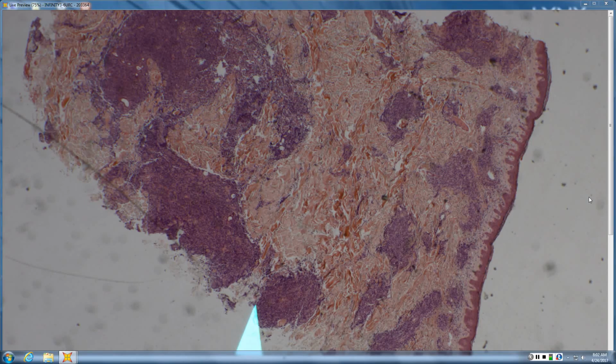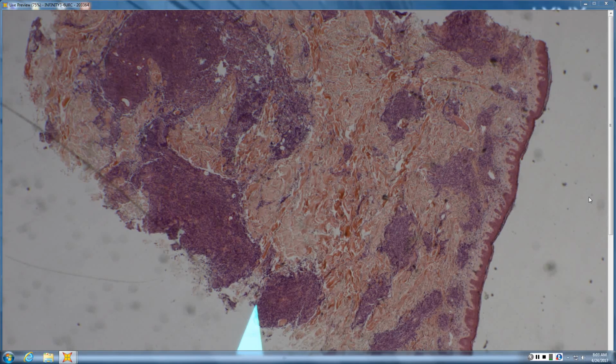In marginal zone lymphoma, if you have germinal centers, those germinal centers can be invaded by the malignant marginal zone cells. So what you see is all the CD10 and BCL6 stay where they're supposed to stay. But the BCL2 don't respect their boundaries. They start invading into those germinal centers. In follicle center lymphoma, it's just the other way around. The nasty piranhas start jumping out of the goldfish bowl, out where they're not supposed to be.